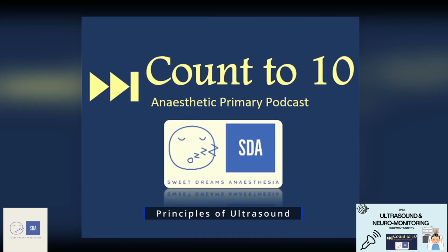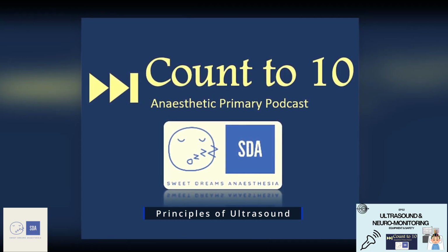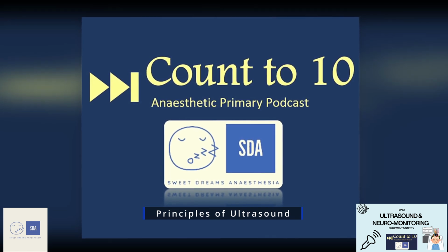So, in summary, with these three examples of acoustic impedance, when we talk about acoustic impedance, we're referring to the individual physical property of that tissue, which is based on that tissue's density and the speed the sound wave travels through that tissue. For us to generate an image, what we're actually interested in is the acoustic impedance mismatch that happens at the boundary of two different tissues. The greater the mismatch, the greater the degree of reflection, and the greater the degree of image generation, which allows us to delineate on our ultrasound image what we think those structures are.